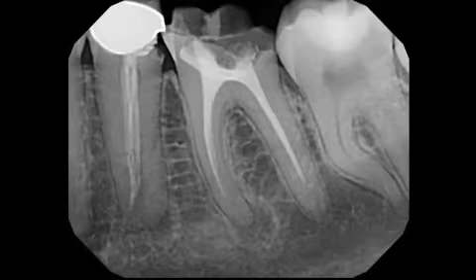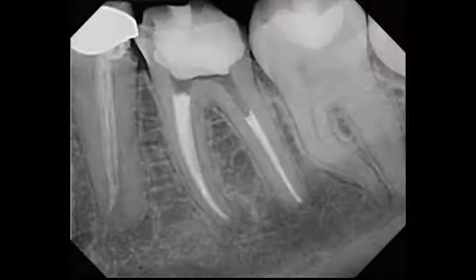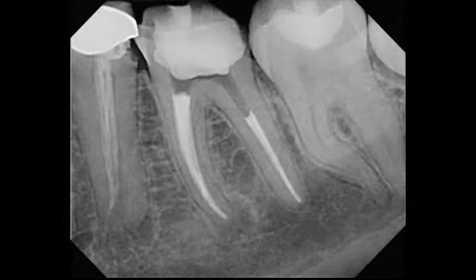A young female patient was referred to me for consultation regarding either endodontic retreatments of teeth 19 and 20, or their extraction and replacing them with an implant. Both teeth were treated overseas about five years prior to this radiograph and were both symptomatic at the time of her presentation to my office. Poor coronal restorations were present as well. In this case, we proceeded to retreat teeth 19 and 20, with tooth number 19 treated first followed by tooth number 20.